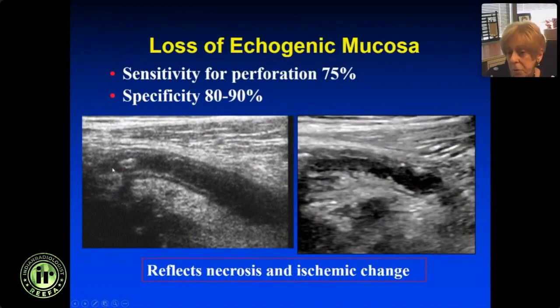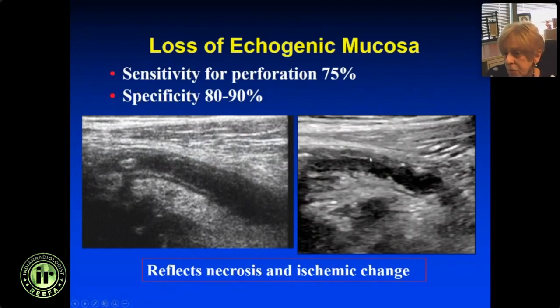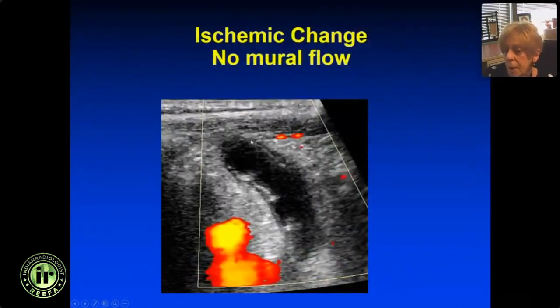Here's appendicitis with a calculus. Follow the mucosa — you lose it at the tip, which is a sign of ischemia and likely perforation. Sensitivity for perforated appendicitis is about 75% with relatively high specificity. Here's another one — you can see bits and pieces of the echogenic submucosa; that's reflecting ischemic change. You're losing the submucosa, and there's a high likelihood that this is perforated or will perforate. If you put color on and there's ischemia, you won't see much flow in the appendix.